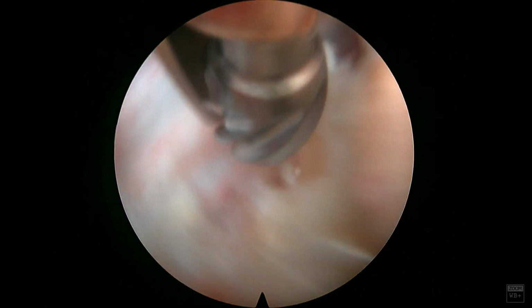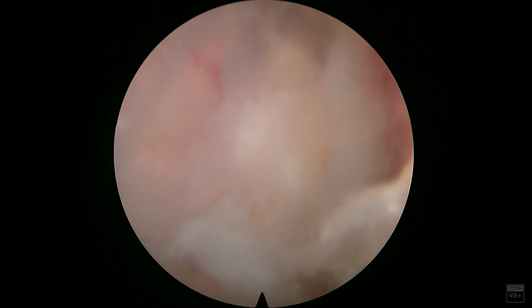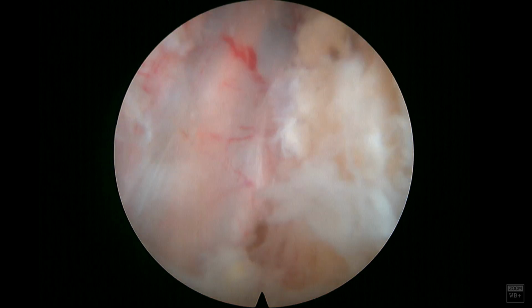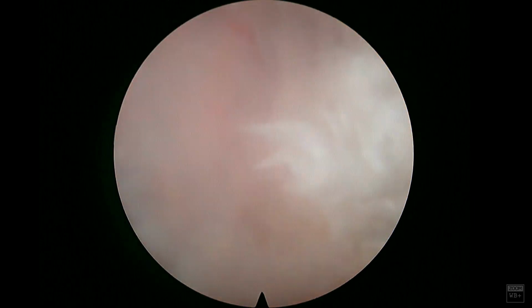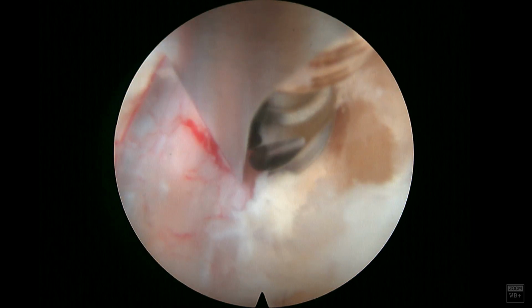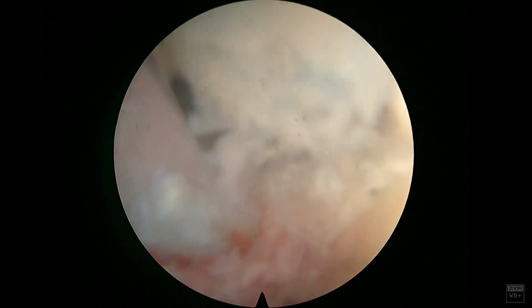Here we'll start using a side cutting burr. This burr is very aggressive, so you really have to be careful holding on to it because it'll stray forward when you start it. I use this to extend my decompression laterally. You'll notice that I don't take any cortical bone up high with it. This is really just to save time on decompressing the lateral recess. I only do it a few seconds at a time to make sure that I'm not straying into the dura and removing any soft tissue that may be in my way.